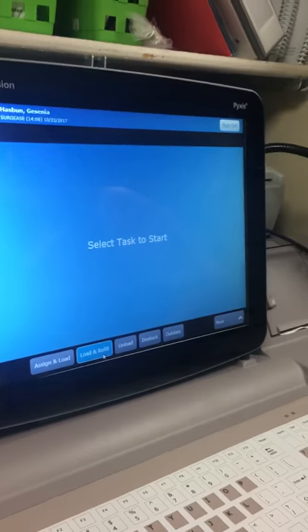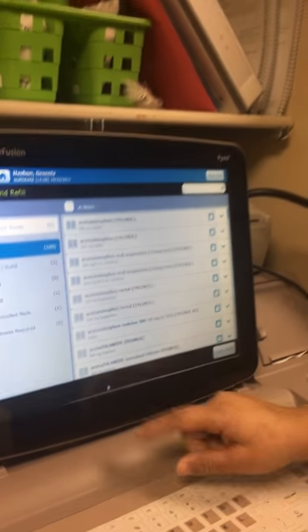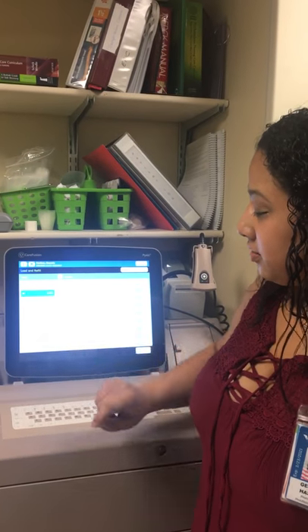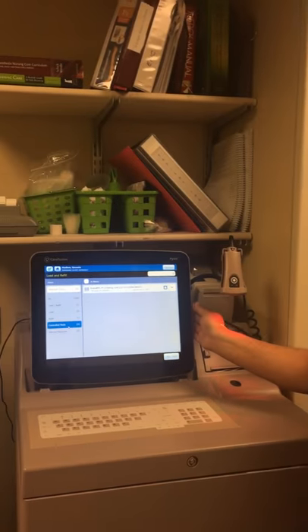Primarily, the technicians on their runs will use load and refill. They can separate the narcotics from the regular medications. For example, by hitting control meds, it separates them from regular medications. The options available are control meds, refill, load, and load and refill. This screen tells us that we must fill fentanyl.